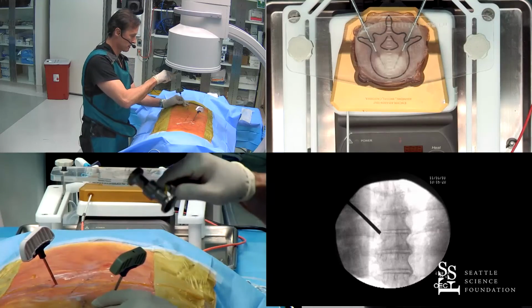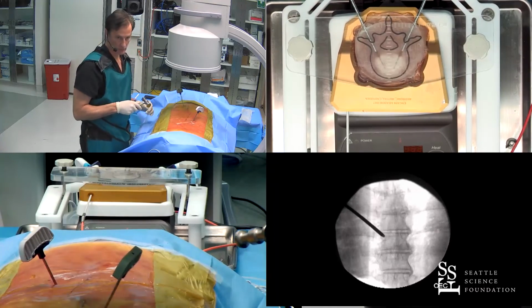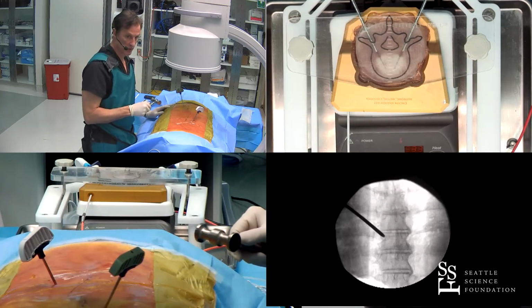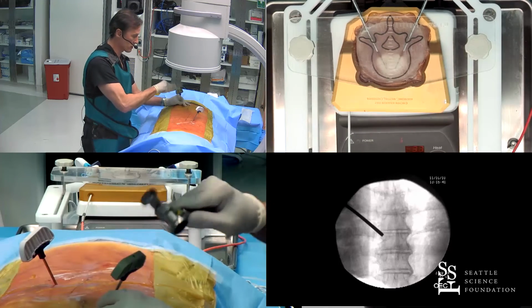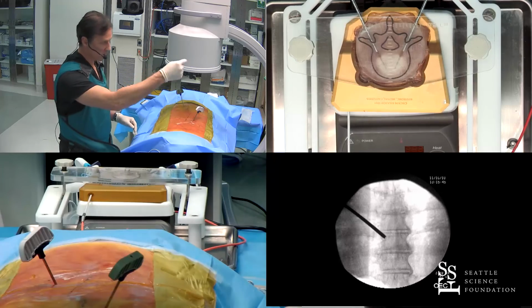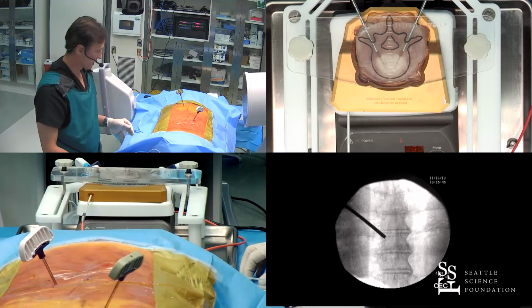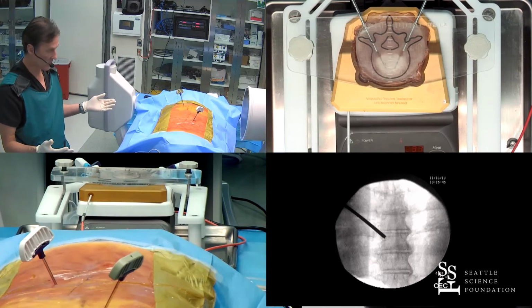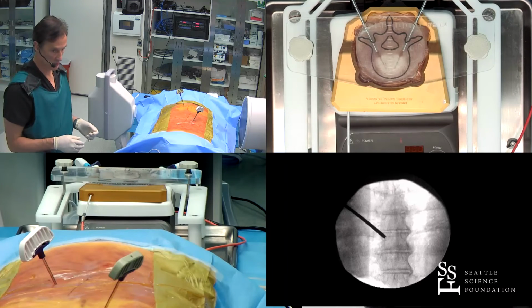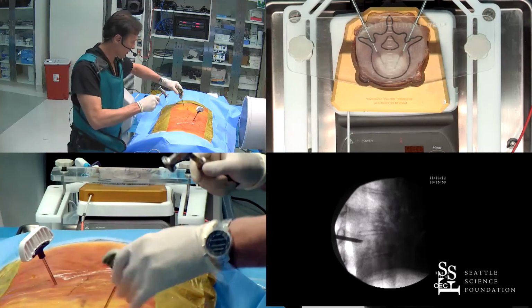And this approach is quite quick. And I'll give myself a little bit of room. The distal tip of the needle, I turned the bevel the opposite way, gave me a few more millimeters. And we'll see before we transgress the medial wall of the pedicle, we'll take a look laterally to make sure we're in the posterior portion of the vertebral body. And again, if we're not, we can make trajectory changes without taking the needle out. If we are, we're good. And so that's about as good of an approach as we can do, as we could hope for.